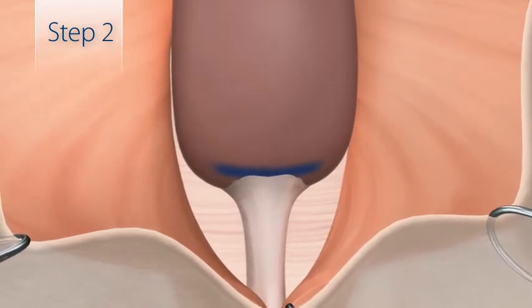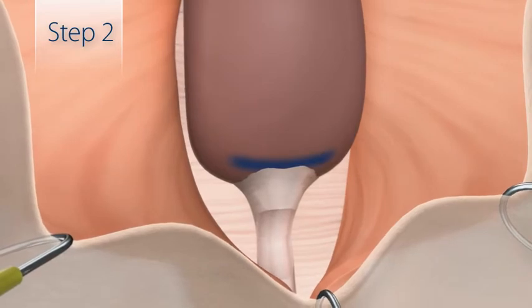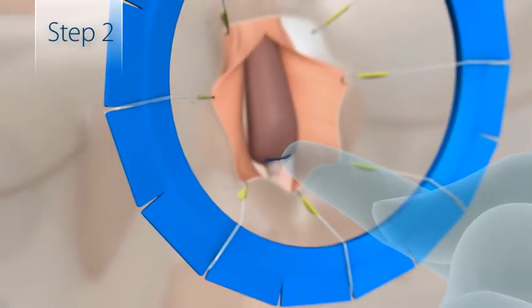Gradually incise the fibrous portion of the central tendon, pausing frequently to check for bulb mobility, until a 2 to 4 centimeter proximal displacement can be achieved.